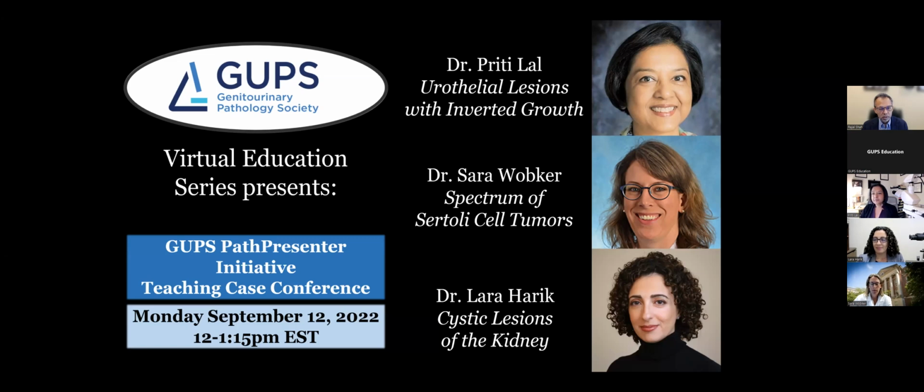Today, in today's webinar, we feature 3 GU experts who will be presenting their interesting cases using PathPresenter, a virtual microscope-based educational platform. Each presentation will be about 17 to 18 minutes, followed by 4 to 5 minutes of question and answer sessions. So please drop your questions in Q&A box.